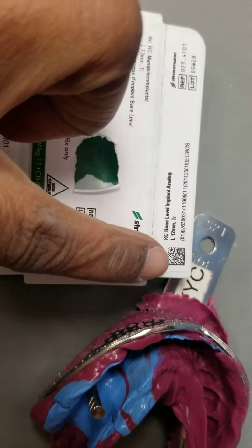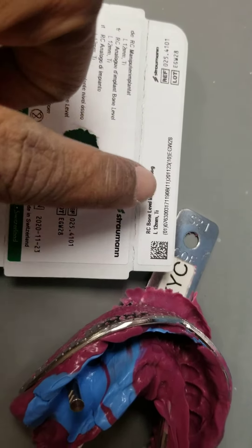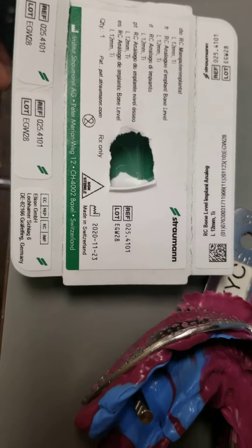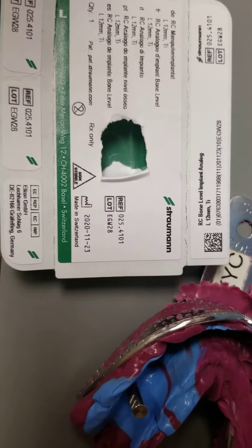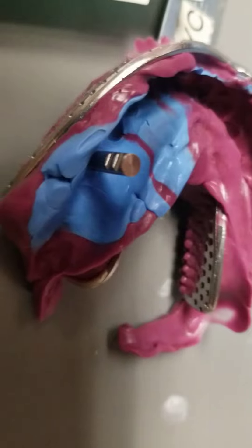There is a code up here, and you can scan those into the system and then reorder them on their website. If you just have that reference number, you can scan it in and order it on the website, which I thought was really ingenious when I saw it. Some of the other companies might be doing that, but that was the first time I saw it. We're going to pour that up.